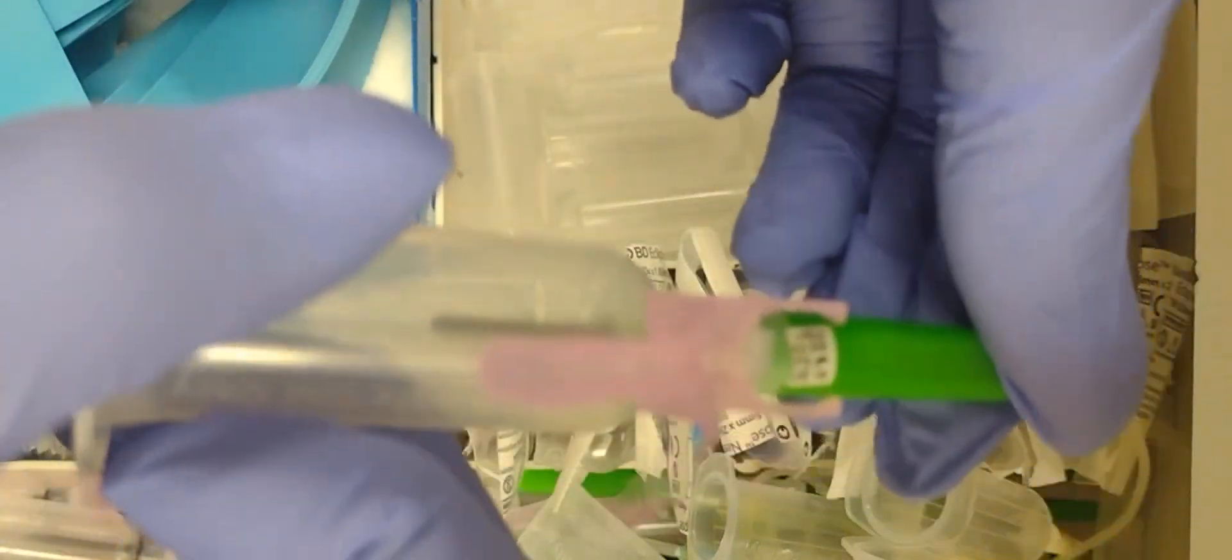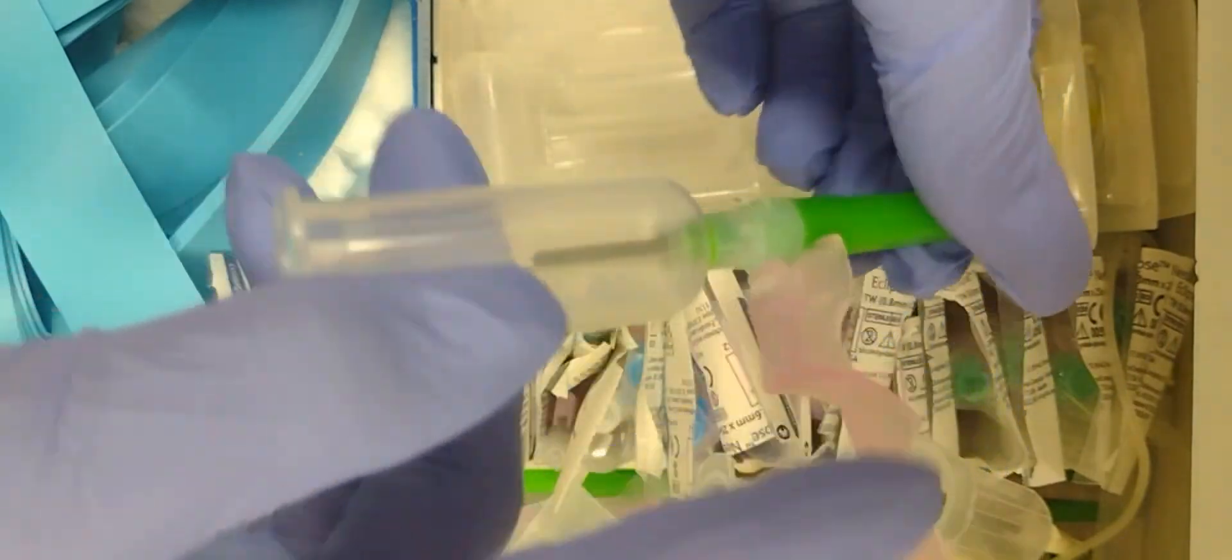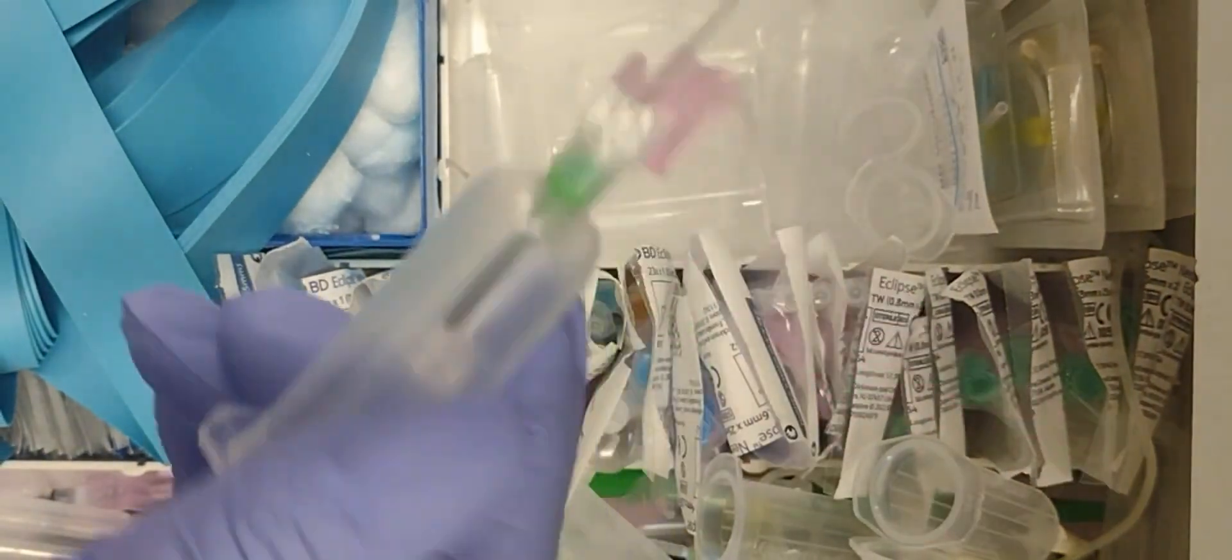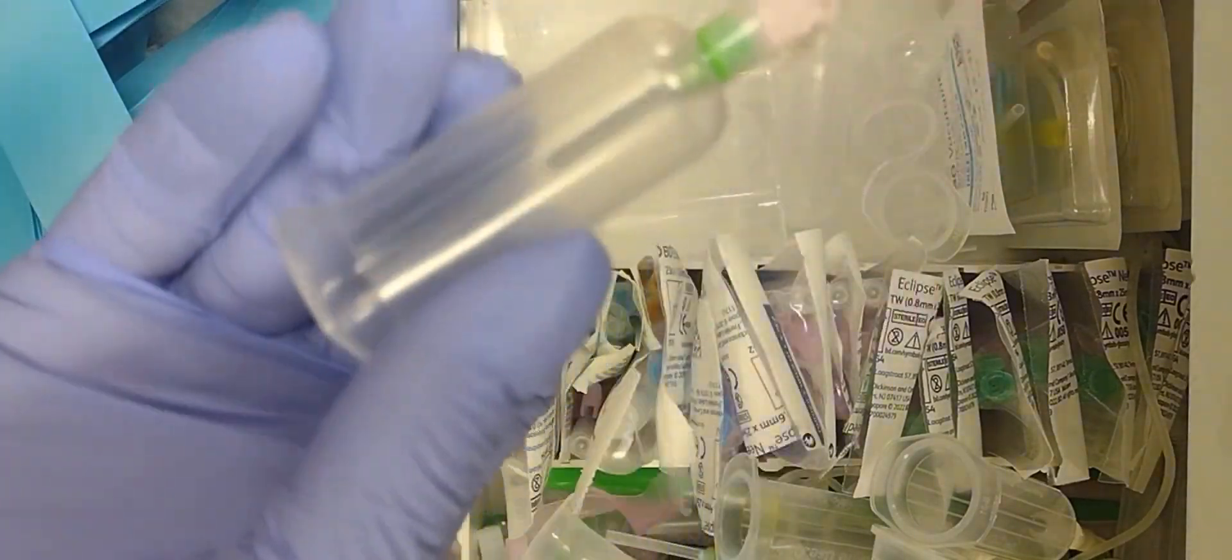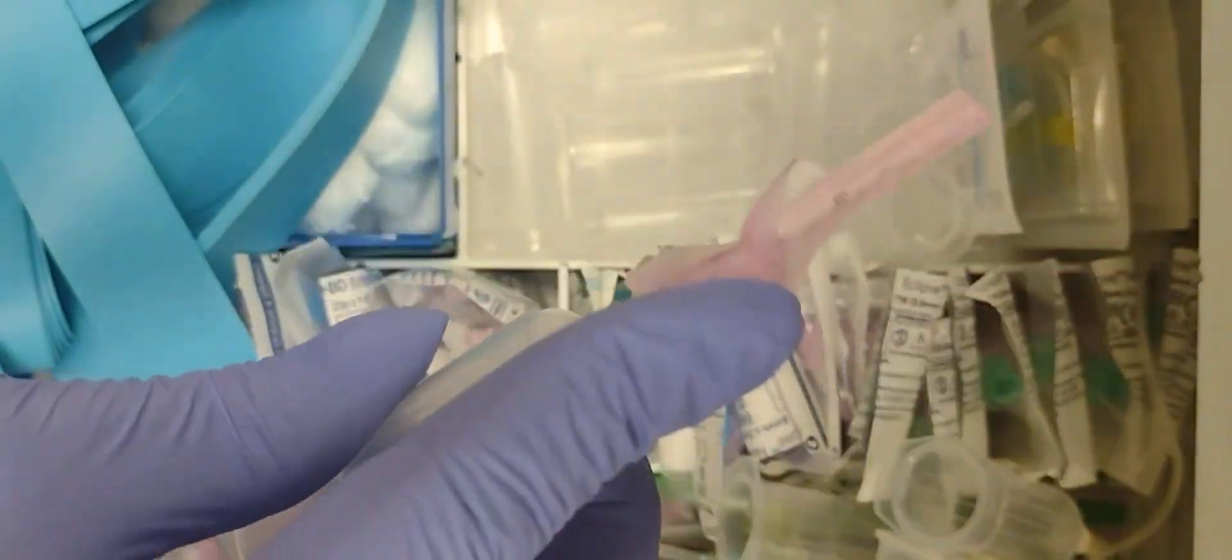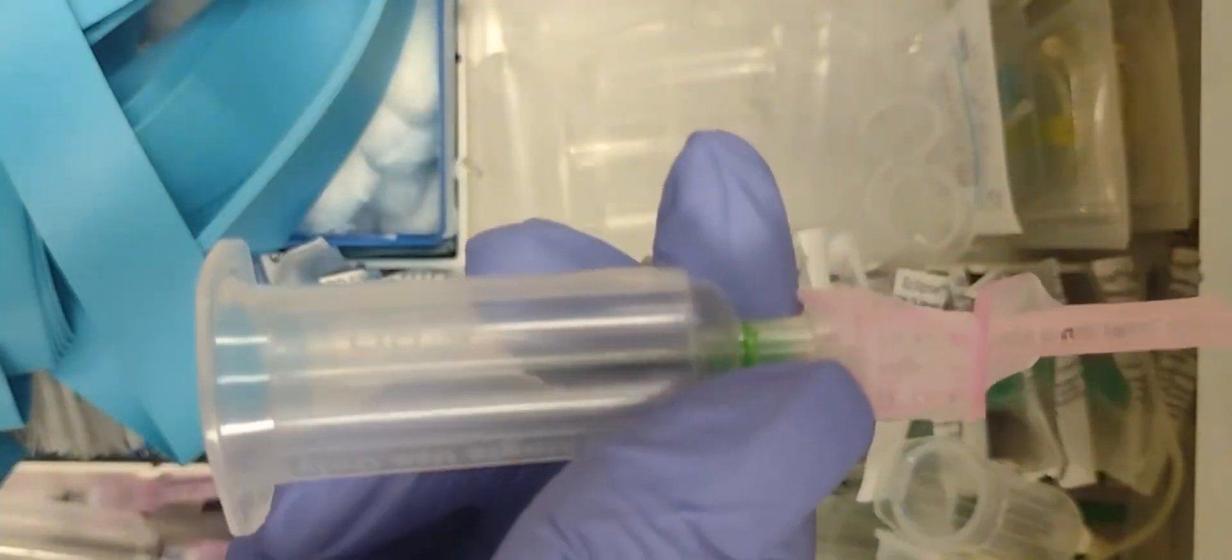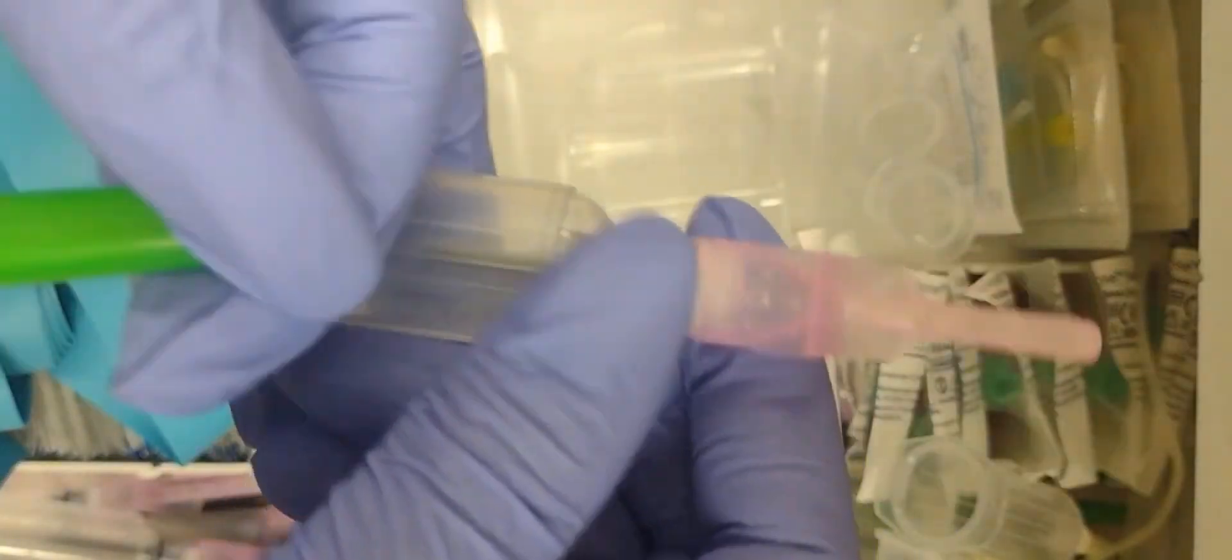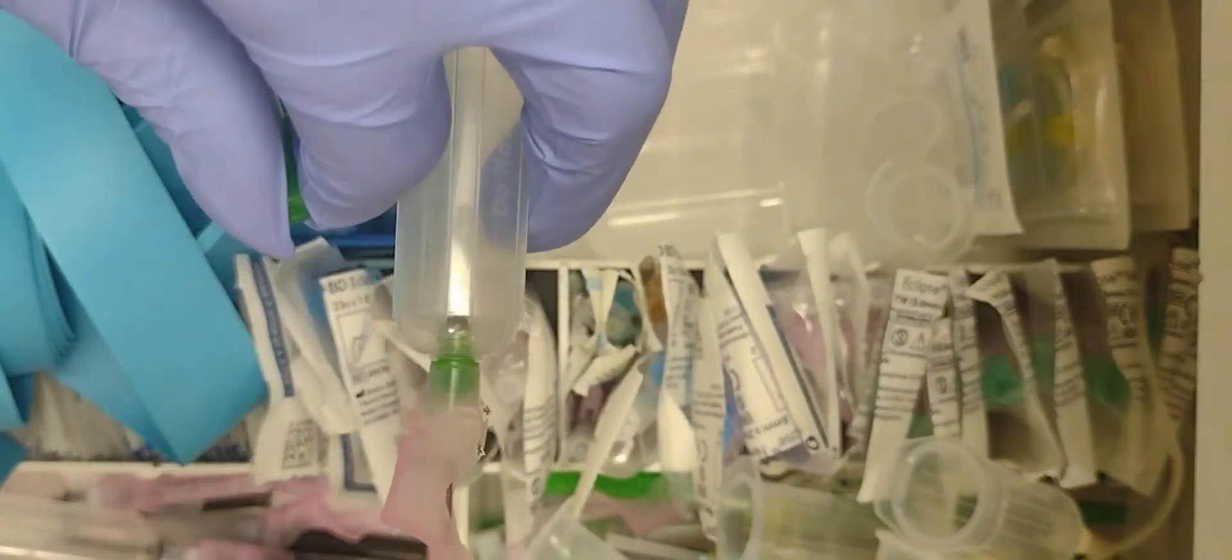Never recap a needle to prevent finger sticks. So once you're done with it, you take it and there's the safety engaged. You don't want to engage the safety cap with your hand at all.